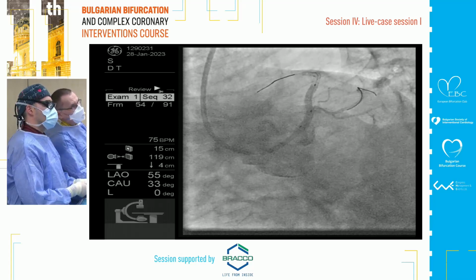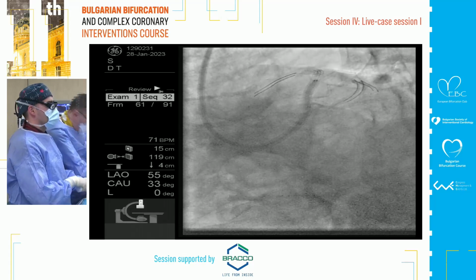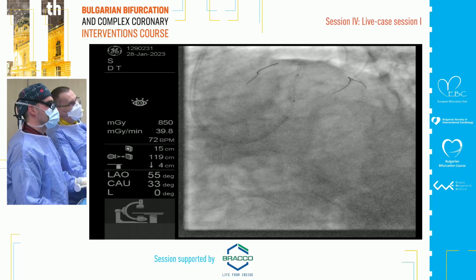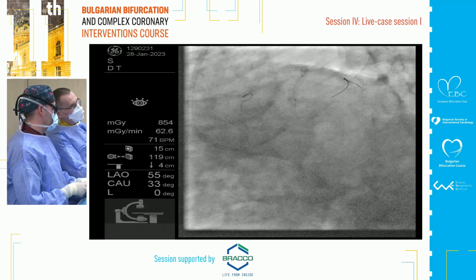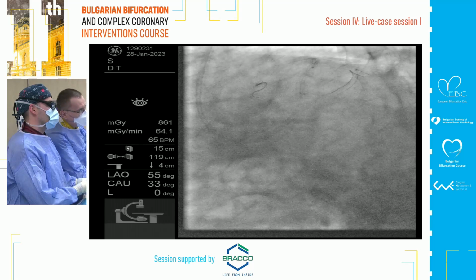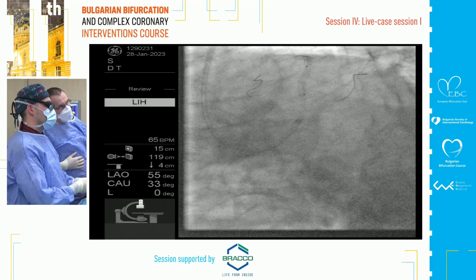I feel that Dr. Nenov is a little bit agitated from the prolonged inflation of the balloon. But this is good. A short inflation and deflation is not enough. The stent is not designed just to expand in a moment. You need time, 30 seconds at least. Well, in this situation, we achieved around 17 or 18 seconds.